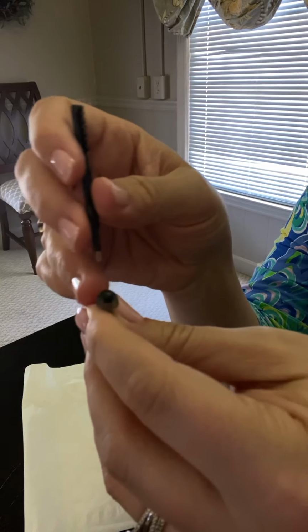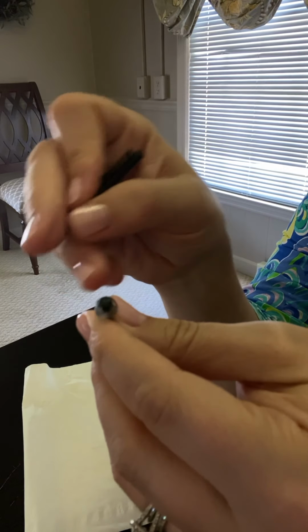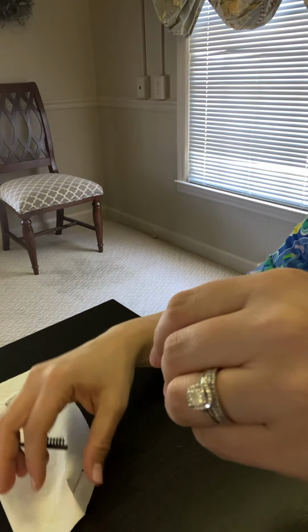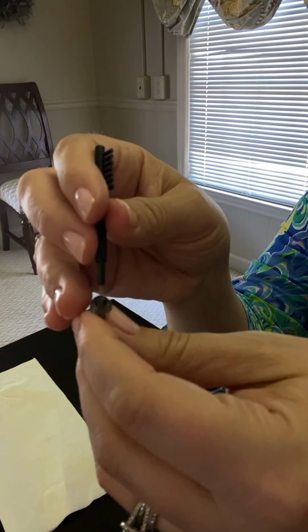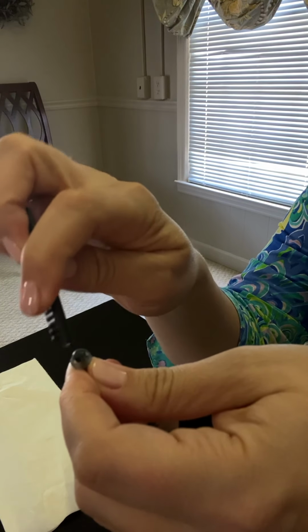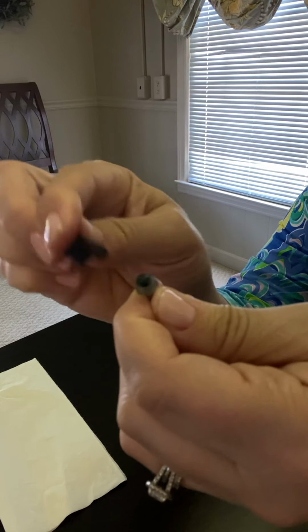On the dome, pick out any wax that might have accumulated, or you can take your cloth and wipe it off. I do not recommend a tissue. This leaves a lint residue, and it can clog your devices even more. So you can pick it out, or you can take the brush and just brush the whole thing off. We do not want to push any wax down in that hole. So keep everything with the intention of pulling it up and out.